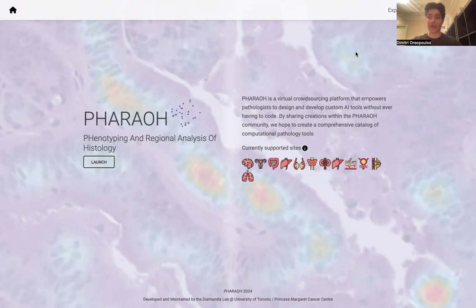For the first time ever, with the Cloud Annotation feature, you will now have the ability to upload, annotate, and submit your chosen whole slide images for the development of your very own PHARAOH classifier, all in a single unified step. In order to harness the power of this remarkable new feature for yourself, you will need to have a set of at least a few pathology slides you are interested in generating a classifier with, and will need to know how to upload these slides to an existing classifier on the PHARAOH site.